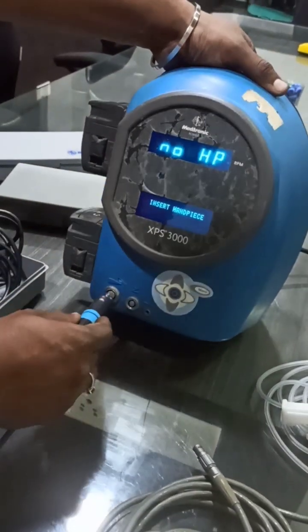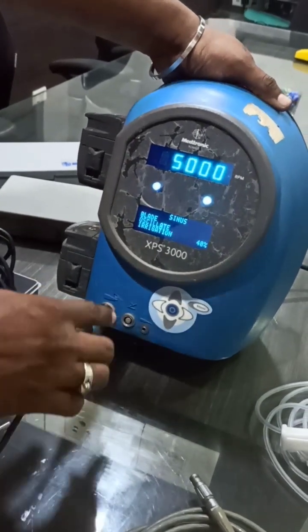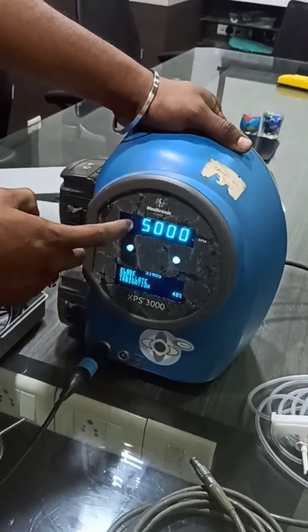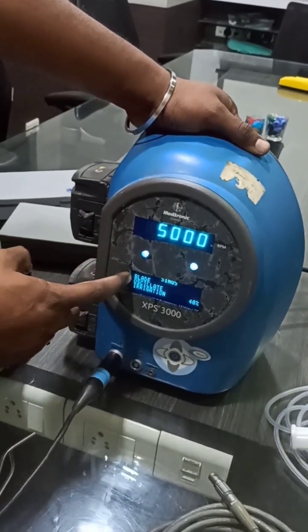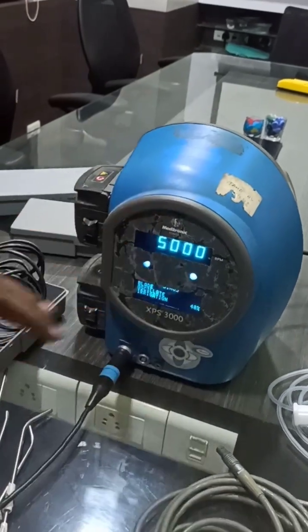I am going to connect it now. Just make it straight and press it inside — the handpiece will connect. Once you connect the handpiece, the settings will come automatically on the display. The RPM shown is 5000, meaning the maximum speed is 5000 RPM. You are now going to connect the blade for sinus surgery.